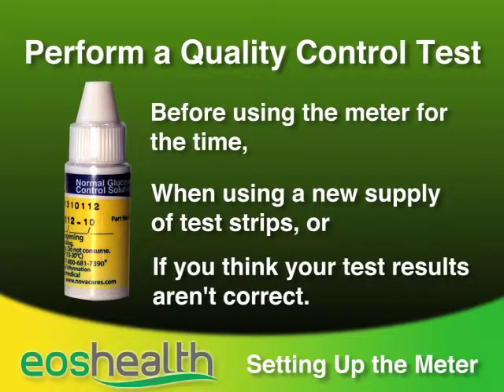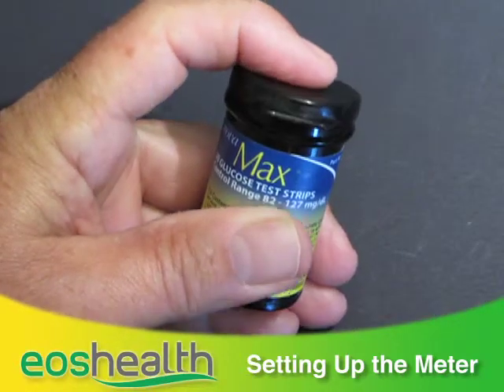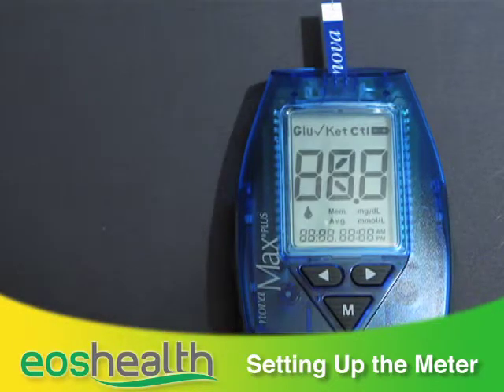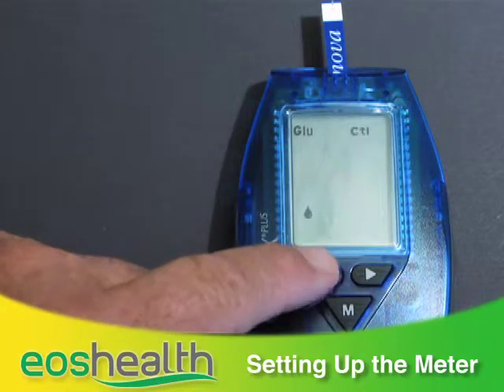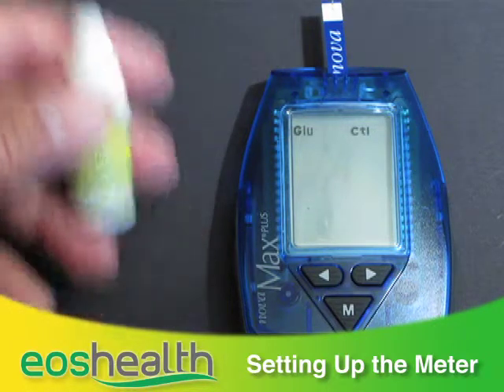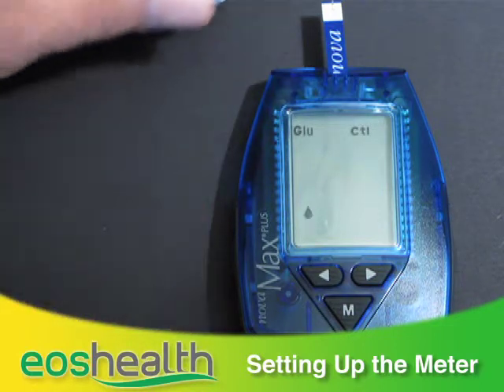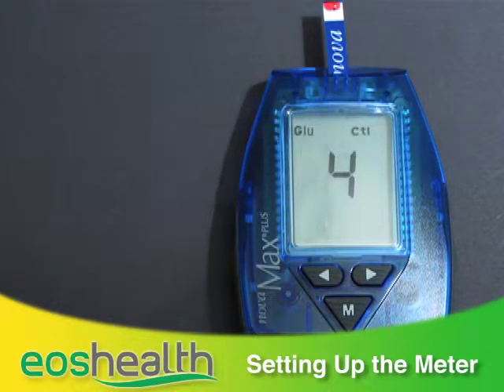Here's how to do the quality control test. Take a glucose test strip from the vial and recap the vial immediately. Insert the strip into the port on the top of the meter — a blinking blood drop symbol and the letters GLU will appear. Press the left or right arrow keys to indicate this sample is a control; the letters CTL will appear. Shake the control solution vial and squeeze a drop onto the cap, then touch the test strip to the control solution. The beeper sounds and the glucose quality control test result appears on screen in about five seconds.